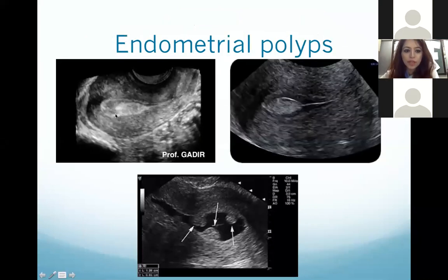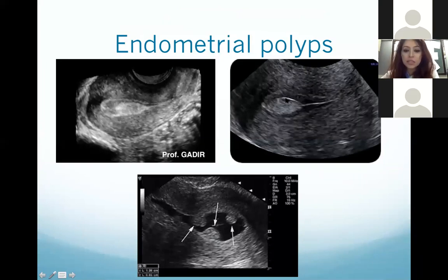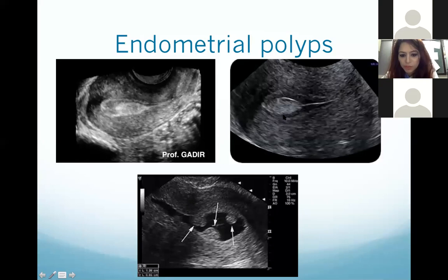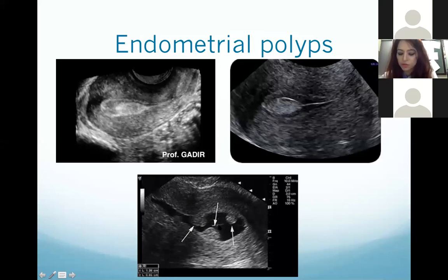These images show endometrial polyps within the endometrium — you can see multiple polyps projecting into the endometrial canal with fluid in the canal. On a simple ultrasound it is very difficult to differentiate whether it is a polyp or a submucosal fibroid. When we instill fluid in the endometrial cavity, we can clearly see polyps projecting into the endometrium, and this is how it helps in diagnosis.